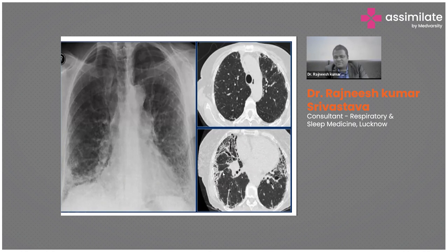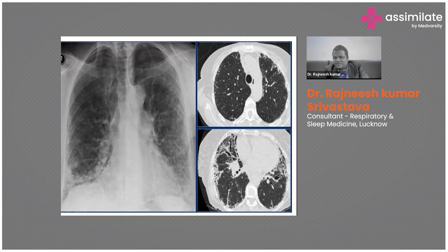Traction bronchiectasis occurs because fibrosis pulls on and dilates the airways. On CT, we can see dilated airways, septal thickening, and honeycombing. The arrows indicate dilated airways in the periphery. These are the key CT features of ILD — septal thickening, traction bronchiectasis, and honeycombing — which we will learn in more detail.